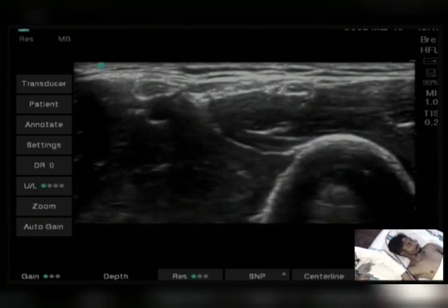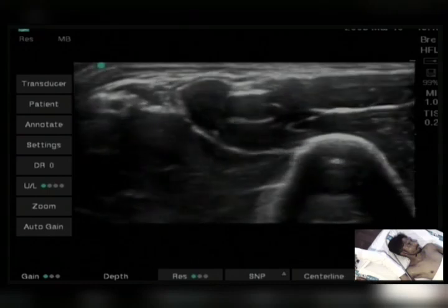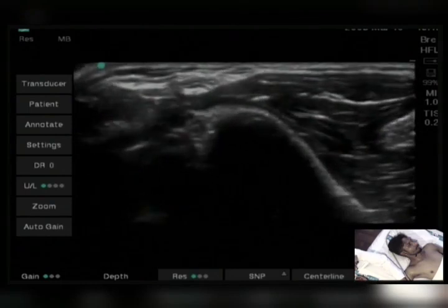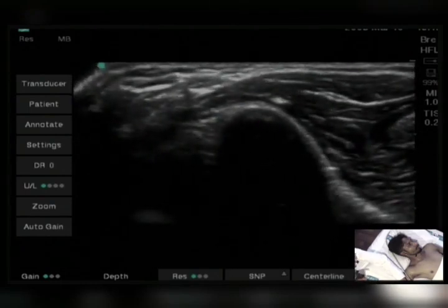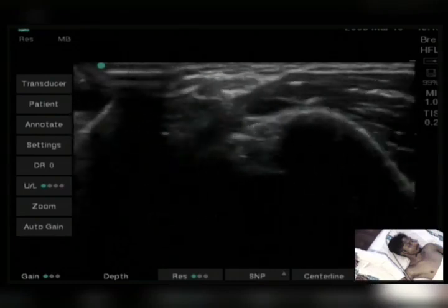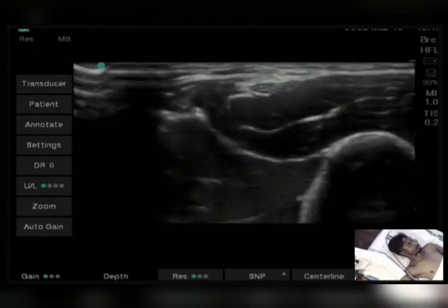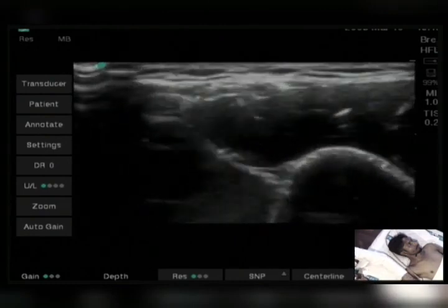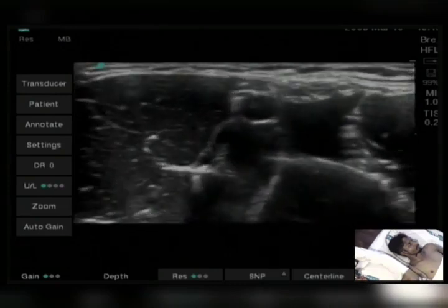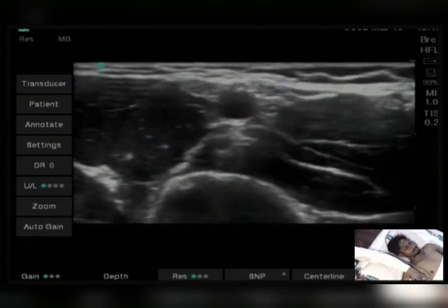Can you see? So this is the medial epicondyle, now reaching up to the medial epicondyle, this one. Okay, so this is the ulnar nerve. In that way you can verify that this is the ulnar nerve, on the top of this one, and it is at the 1 o'clock position with the artery.